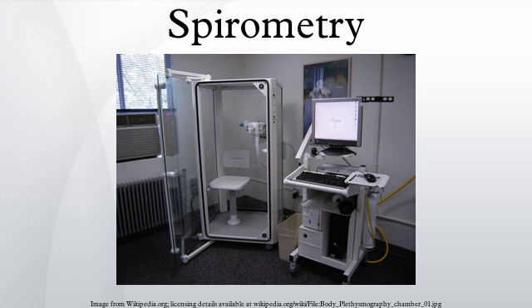A sudden decrease in FEV1 or other spirometric measure in the same patient can signal worsening control, even if the raw value is still normal. Patients are encouraged to record their personal best measures.